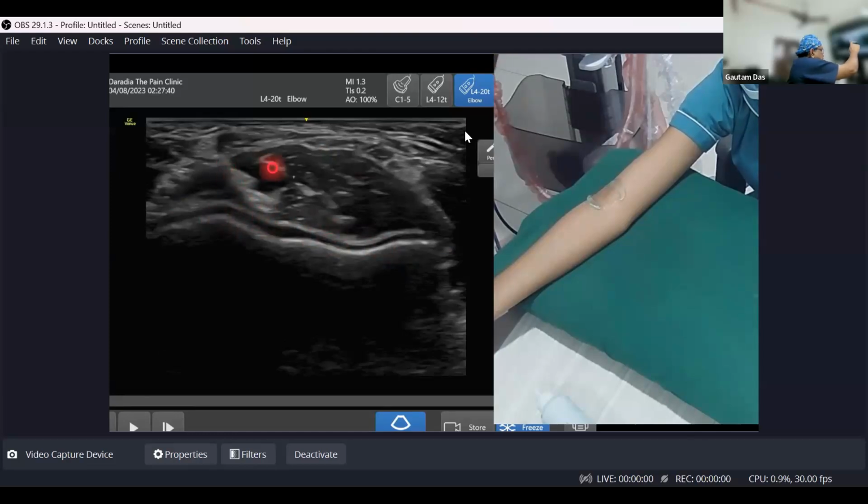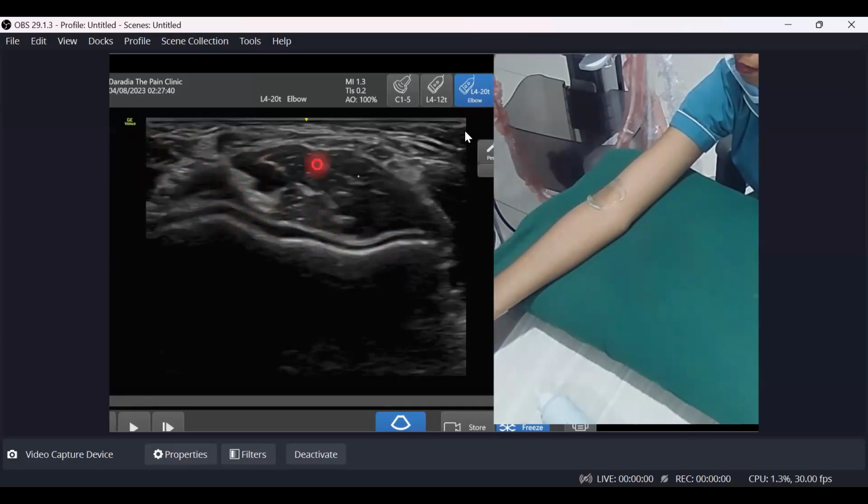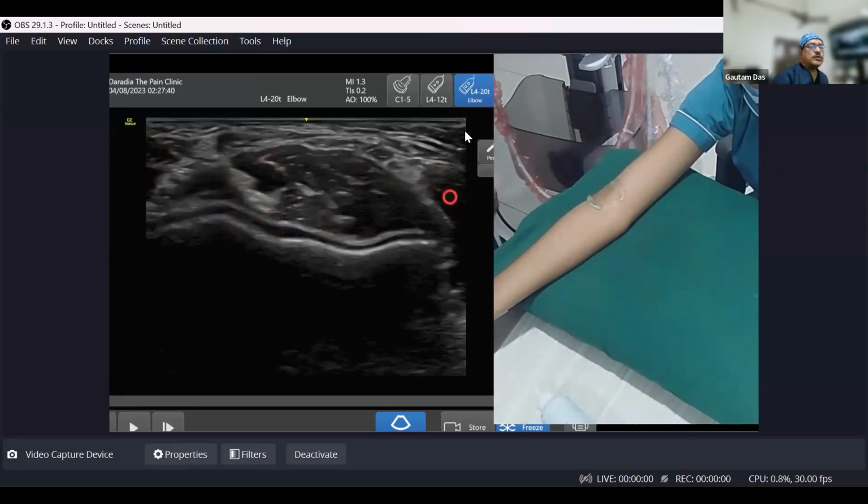And there are some septa, fibers connected to septa. Which muscle is on the lateral side? Brachioradialis. And on this side, the little bit of muscle you can see is your pronator teres. So this is the home page. As soon as you get it, you stop there. And then what is important, on top of this brachialis muscle, we are going to see the BAM, B-A-M. So this is your long head and short head of the biceps. The lateral side is your long head, this side is your short head. And then we have the brachial artery, and then the median nerve here.